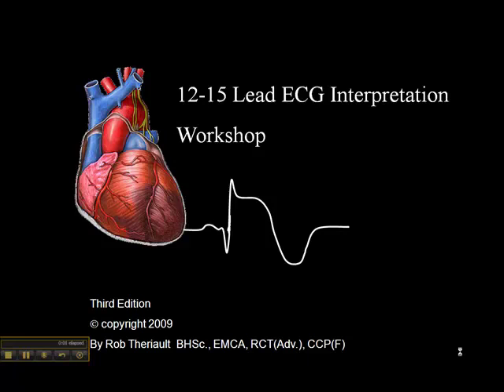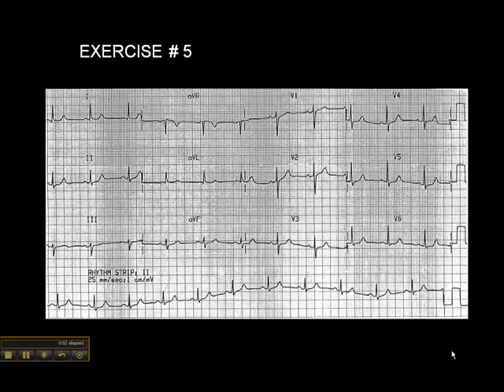We're on exercise 5 on page 43, and we'll go through the ECG from left to right. There's no ST elevation in lead 2, no ST elevation in lead 3, and no ST elevation in AVF, so we can rule out inferior wall MI.